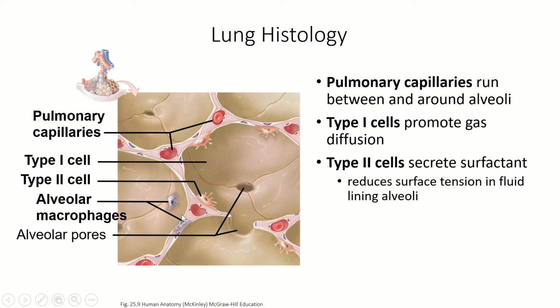Then we have one other thing I'm sure you noticed. We have macrophages. Remember, macrophages are cells that do phagocytosis. Macrophage means big eater.